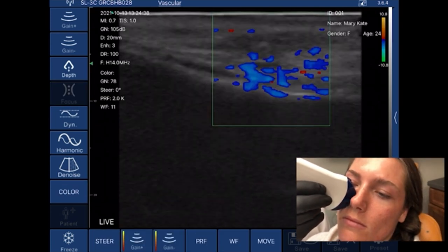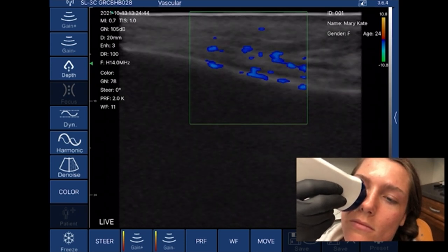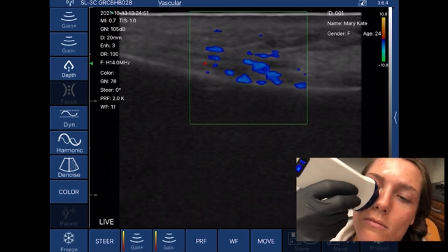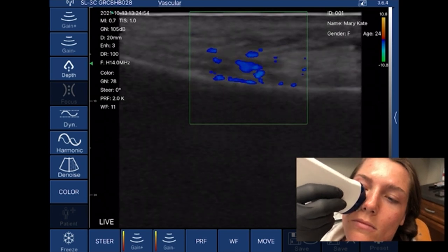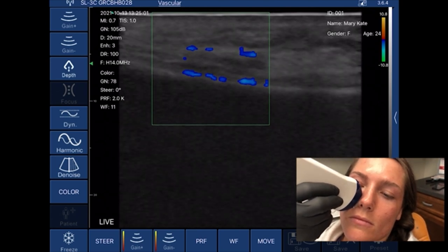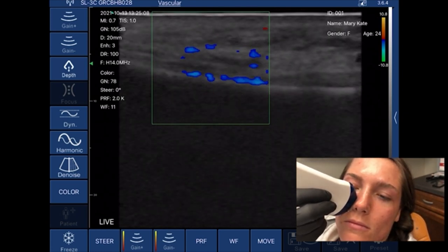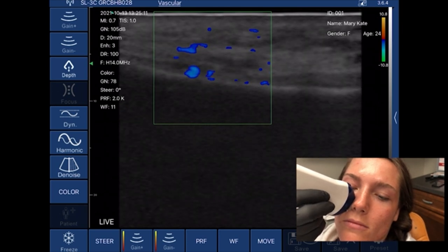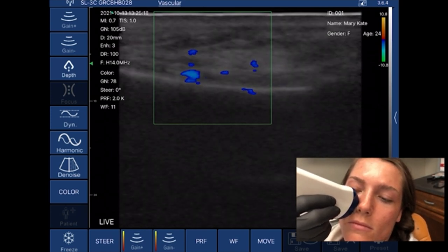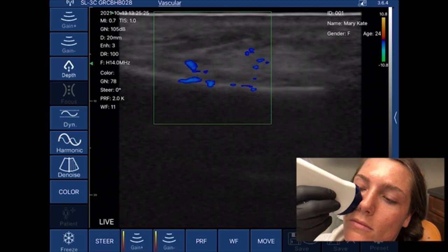How do I know where the vessels are? I'm going to go to color mode, and that is going to show us what we are looking for. I'm going to move to different areas of this deep piriform fossa right here. You will see some artifacts every time I move, especially when using color Doppler. We're going to move this color Doppler around and take a look. On her, this is interesting because you can see exactly where that facial artery is — and it is right on the bone. That's not where you would typically think to find the facial artery.